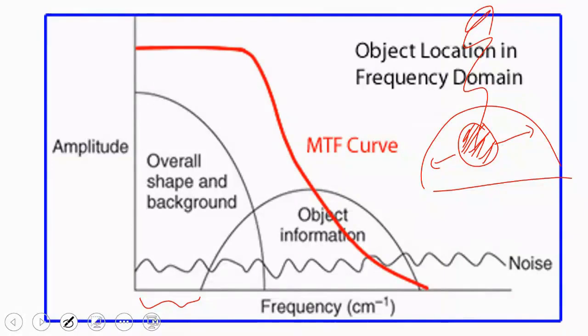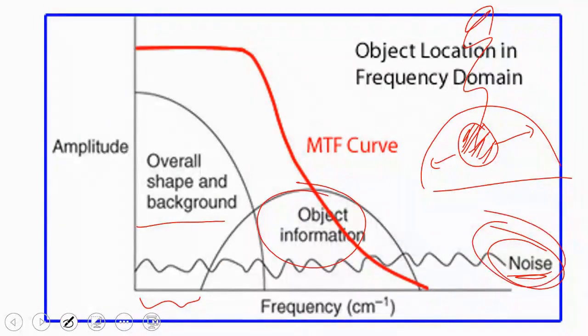It's not very large. The significant noise present in the image represents the extremely small and intricate objects that you cannot detect, and therefore causing significant distortion in the overall image quality. Additionally, you have 3 distinctly separate regions, namely the background, the object information, and the noise area.